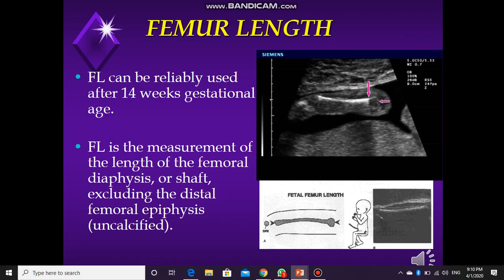We can use femur length also after 14 weeks, and the measurement is the length. We are using the diaphysis or the shaft, but not the distal femoral epiphysis.